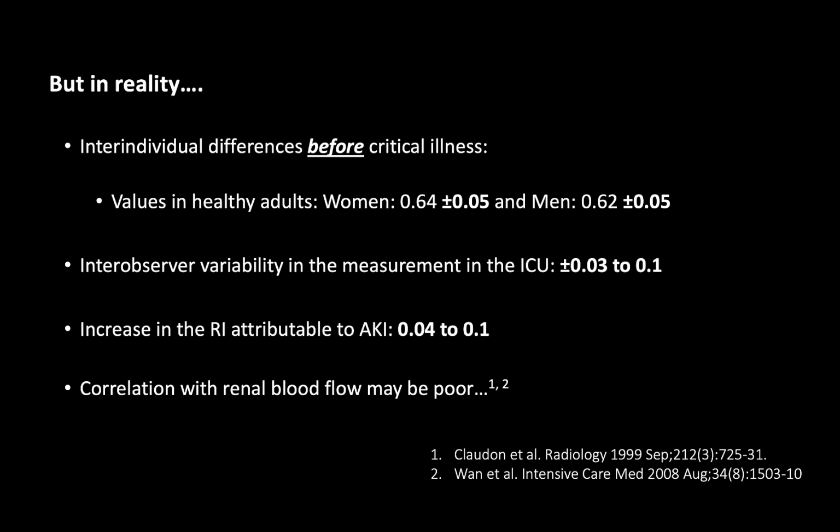Finally, an increased renal resistive index does not necessarily mean that the renal blood flow is poor. Indeed, remember that velocities and flow are related, but the flow is highly dependent on overall cross-sectional area of vessels. As such, lower velocity does not necessarily mean that there is less flow to the kidney.